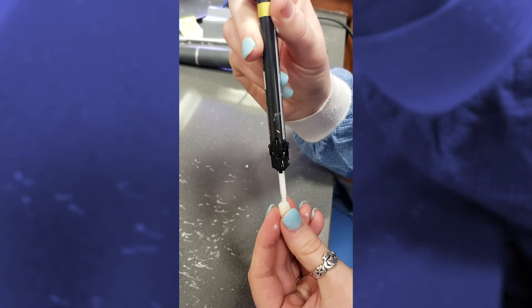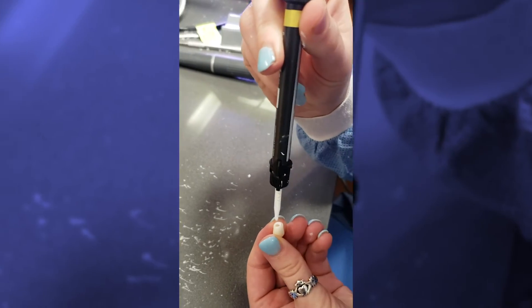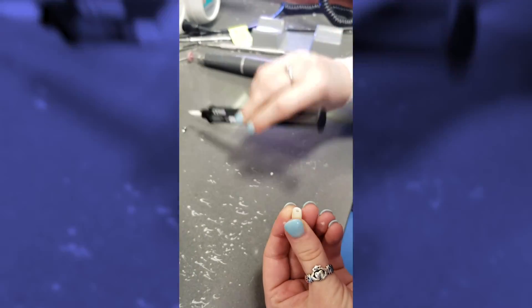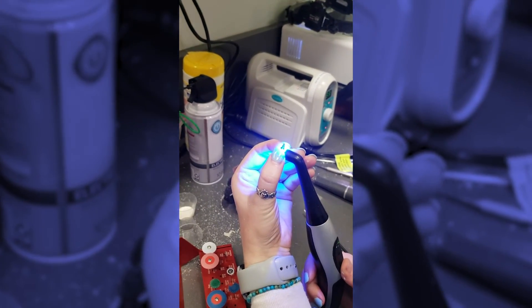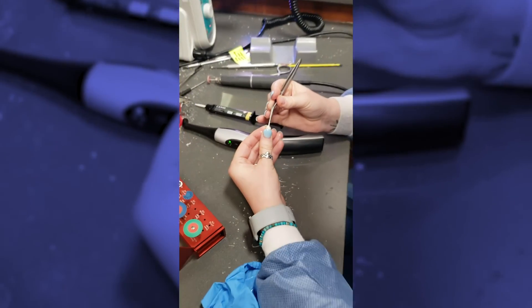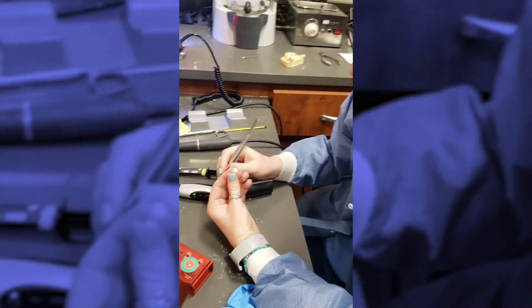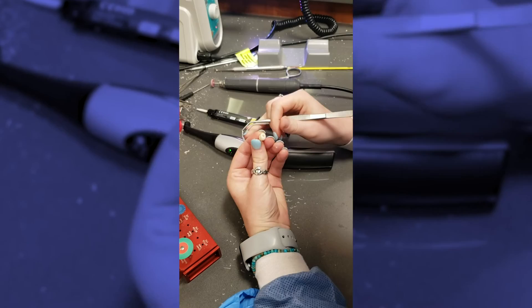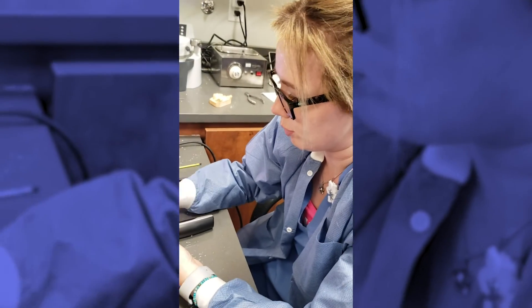Is it like some glue or something? Yep, it's cement for the crown to link onto the ti-base. So we put a little Teflon tape down in that ti-base — there's a little screw in there and you don't want the cement getting on top of the screw. So we put a little Teflon tape to protect it, and then we pull it out when it's done, and then we're gonna go put this in her mouth.